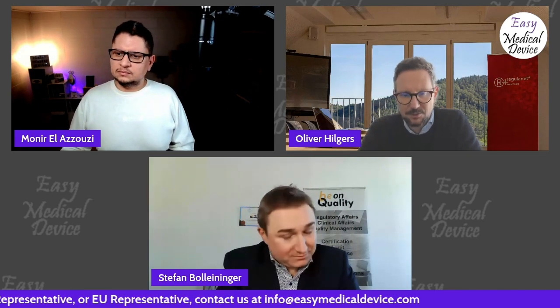As this is not reflected in Rule 11, there's definitely room for interpretation to say that this is not applicable. So if you have a software that predicts or prognoses, then it does not fall under this first part of Rule 11, because this usually cannot be taken for a therapeutic decision or a diagnostic decision, because it's upfront still.